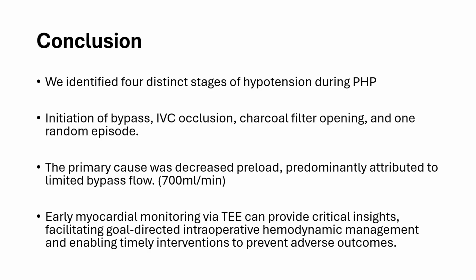We identified 4 distinct stages of hypotension during the PHP procedure. The first one was the initiation of the bypass. The second one was the IVC occlusion. The third one was the charcoal filter opening, especially the second one, and the fourth, 1 random episode.